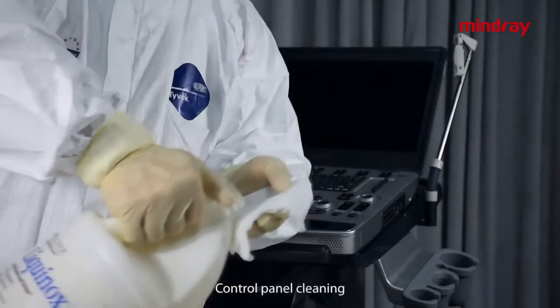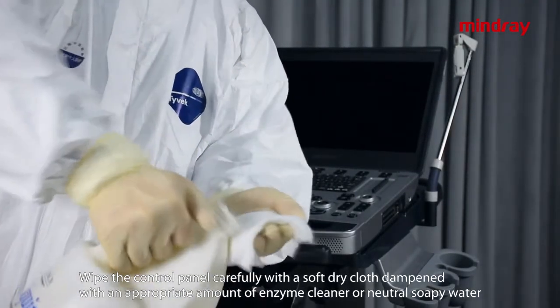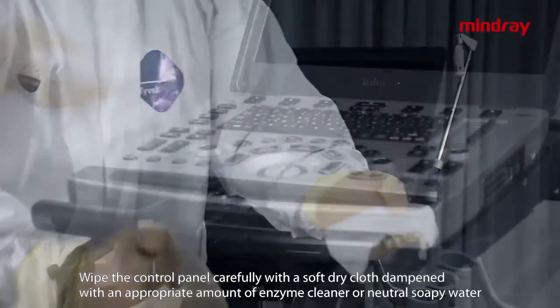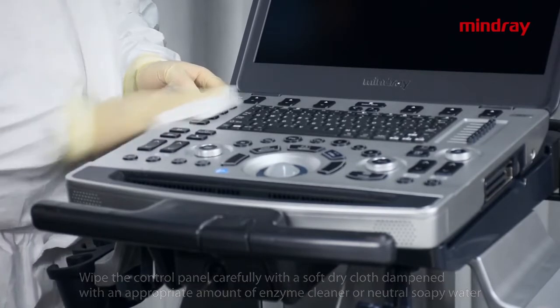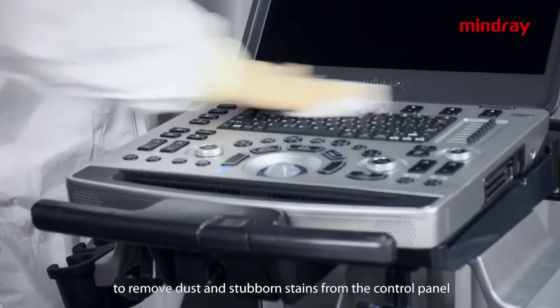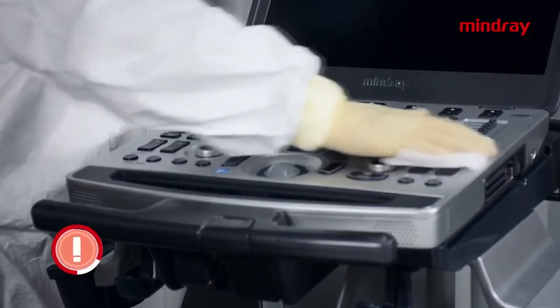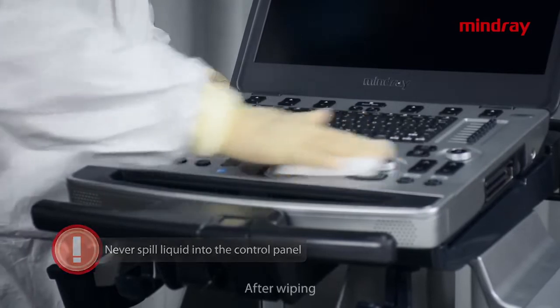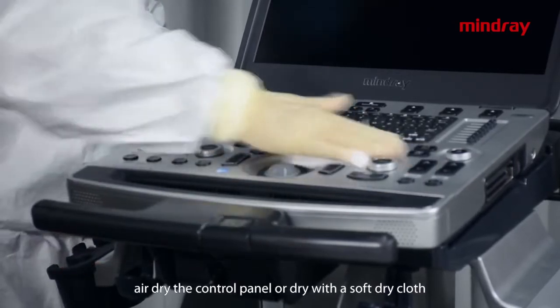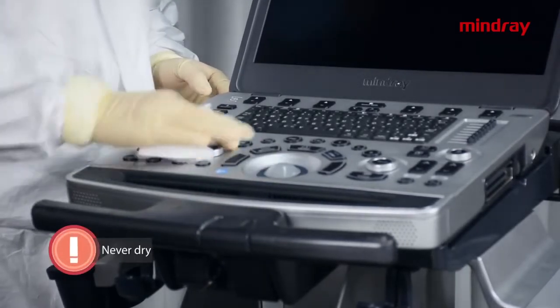Control panel cleaning. Wipe the control panel carefully with a soft dry cloth dampened with an appropriate amount of enzyme cleaner or neutral soapy water to remove dust and stubborn stains from the control panel. Caution: never spill liquid into the control panel. After wiping, air dry the control panel or dry with a soft dry cloth. Never dry the control panel by heating.